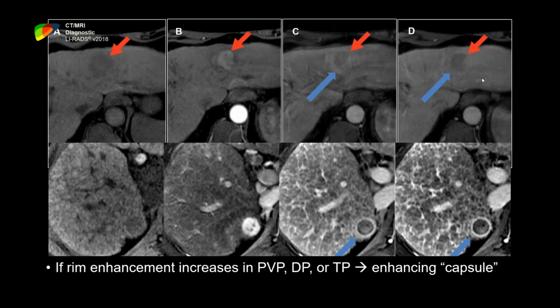Patients are still getting somewhat short of breath, but the effect that it has on image quality is lessened because you're expanding the bolus over time. It works very nicely, actually. At least in our experience, it works very nicely.